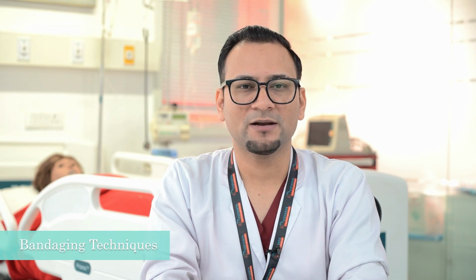In this video, a nurse will understand the various aspects of the bandaging technique, steps of procedure, articles required, aftercare, and most importantly, what to do when things go wrong. In other words, the common clinical errors.